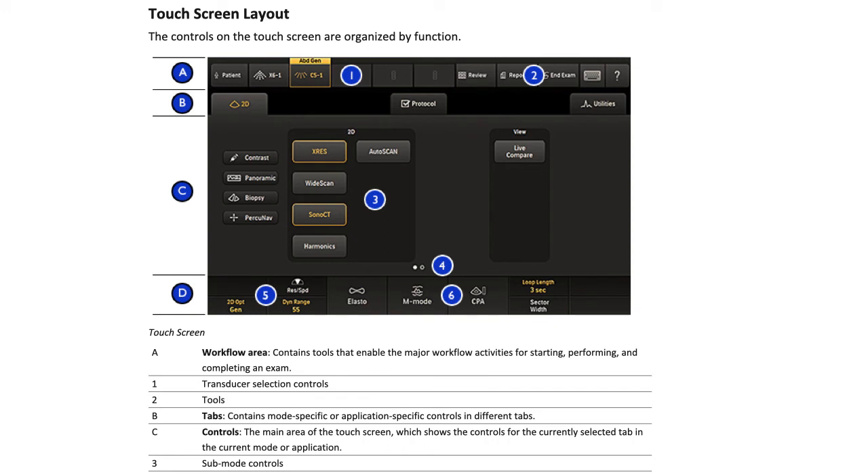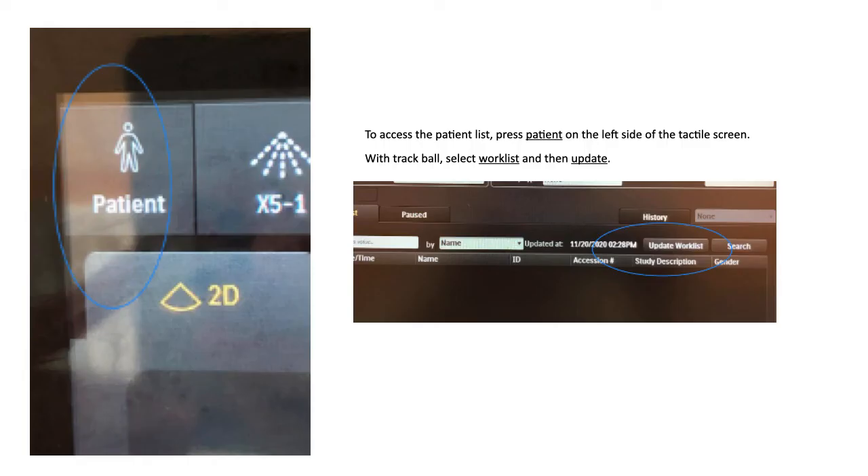Here is an example of the touchscreen layout. On top you have the patient tab for selecting the patient and inputting name and file number. Next to that you'll see all your ultrasound probes to select. Clicking on patient allows you to update your worklist and obtain which patient you want to scan, if your machine is connected to PACS and has a worklist system.